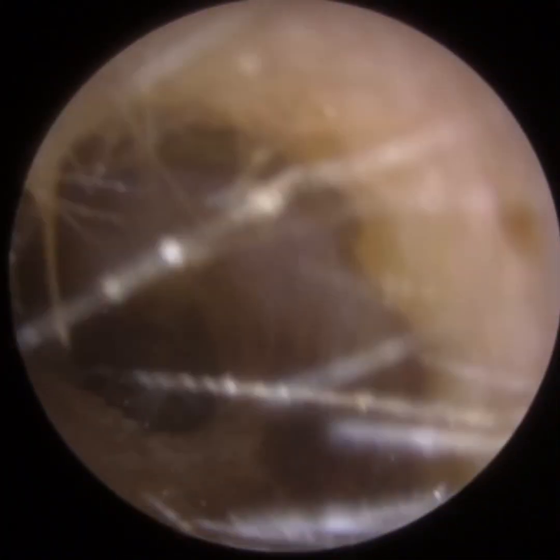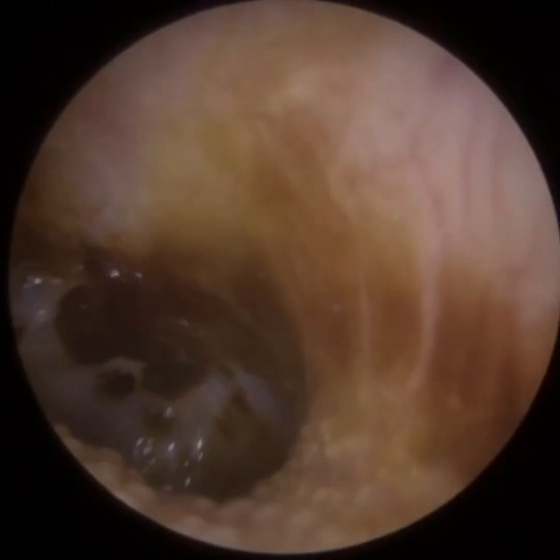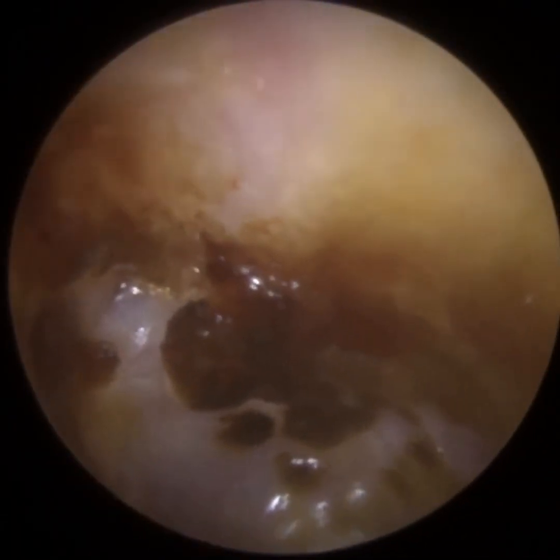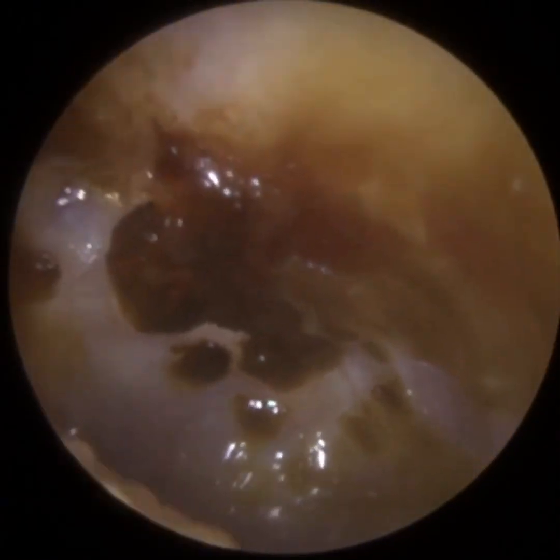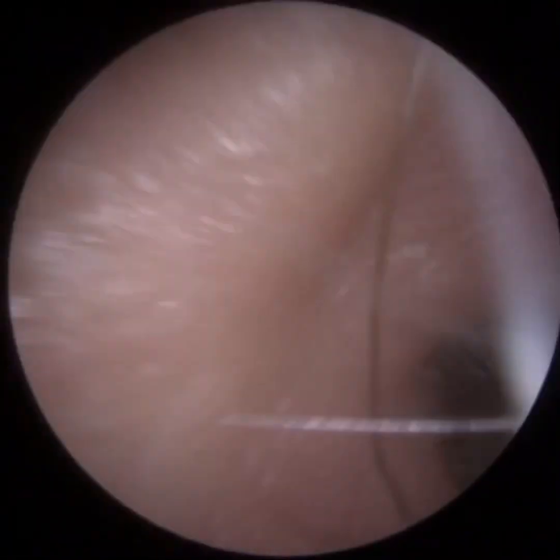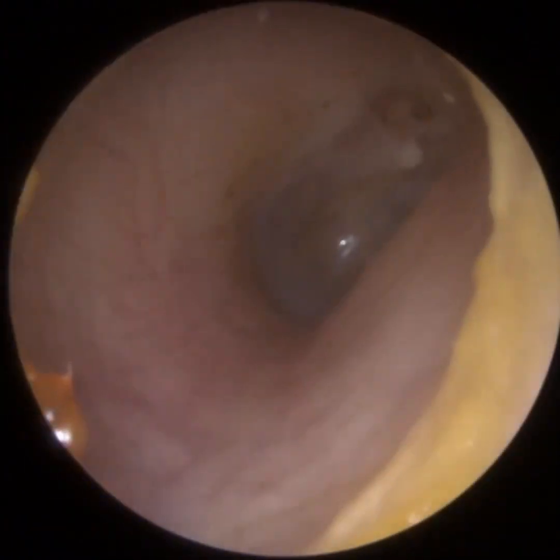This is of a dead skin peel. I haven't done one in a while, I don't think, and I know a lot of viewers enjoy the skin peels. So this patient had a recent ear infection, and this is their left ear. We're also examining the right ear so you can see the difference.